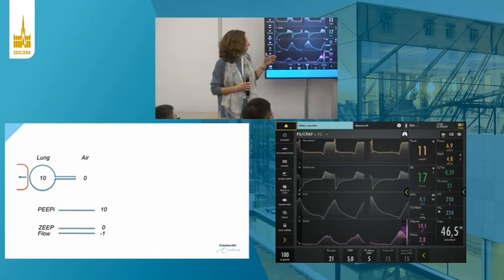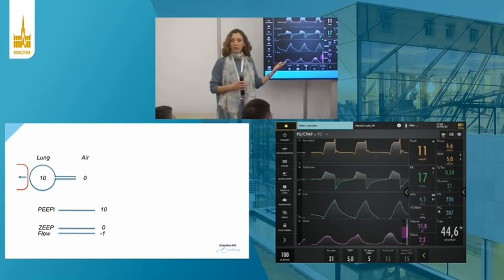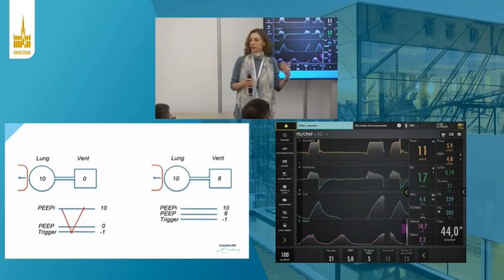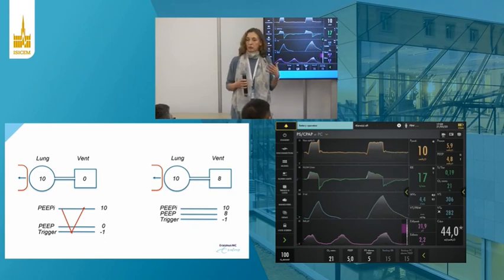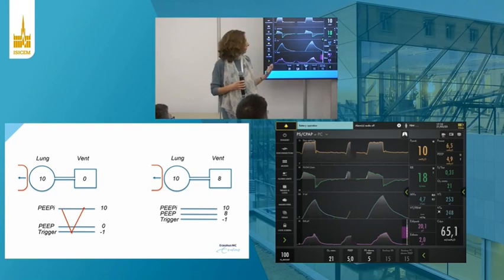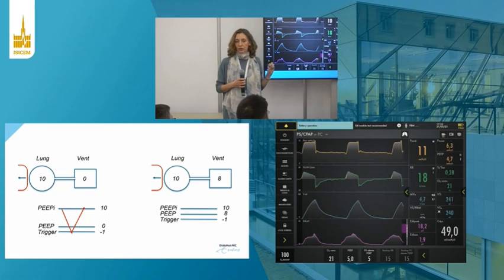And we can adjust it either by adding some external PEEP, but also by reducing the level of assist. Because if we give the patient a high tidal volume, then he or she is not able to have time to exhale this high tidal volume. So decreasing assist is the first step we can take to manage a patient with ineffective efforts.